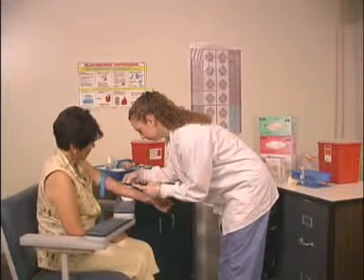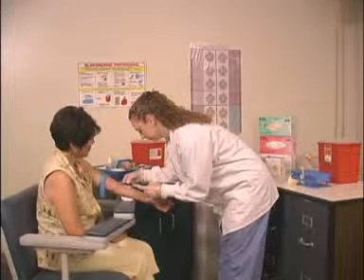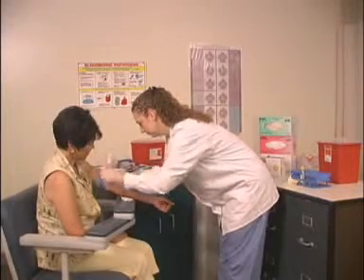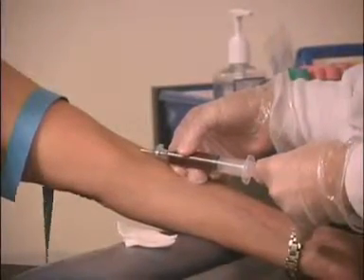Releasing the tourniquet and opening the fist allows blood flow to return to normal and helps prevent hemoconcentration. According to CLSI standard H3A5, the tourniquet should be released as soon as possible after blood begins to flow and should not be left on longer than one minute. Venous blood will not automatically flow into a syringe.